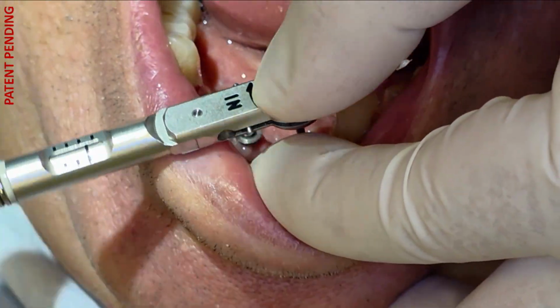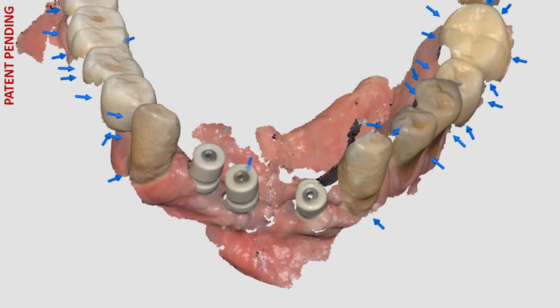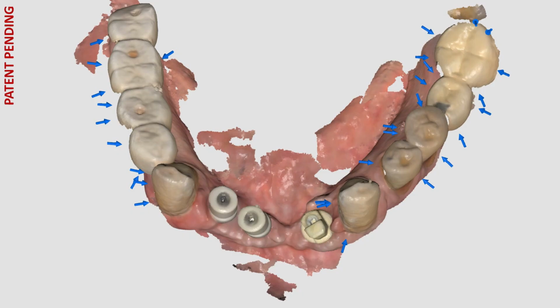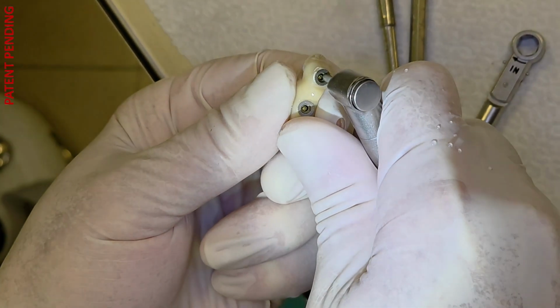The triangular indexing of Crest Fit and the scan abutment orientation must always face the buccal side. I use the previous scan, cut out the required region corresponding to tooth 32, and perform an additional selective scan of that area. At this stage, I do not want to remove the Crest Fit multi-unit again and replace it with the Pro multi-unit, as unnecessary manipulation could traumatize the patient.